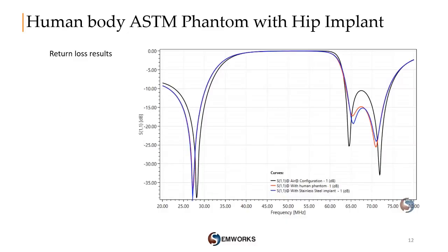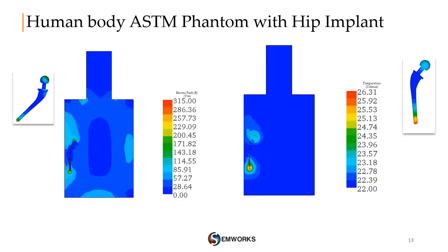Now when adding the metallic hip implant, we can notice that there is no big effect on the return loss results. But for the electric field distribution, which is shown by the left figure, an increase to 315 volts per meter is noticed around the metallic implant, followed by a significant temperature increase of 4.3 degrees Celsius after the same period of 15 minutes of heating.